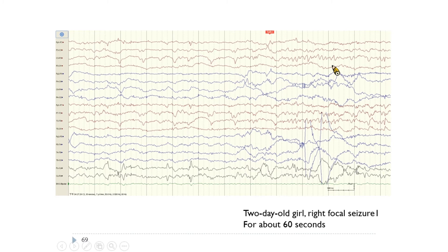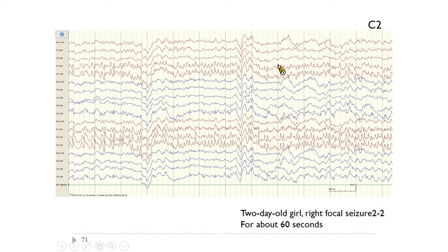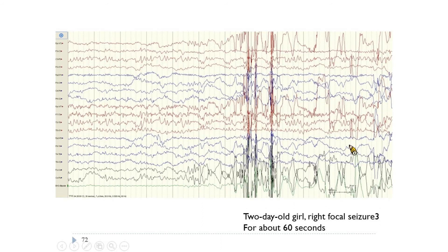This is another episode. Again, there appear to be positive periodic discharges with a broader field involving central and temporal areas, with rapid development of rhythmic discharges ranging from theta to alpha range. Changing to a CZ referential montage, we can see the maximal amplitude is at T3 and T5, continuous, resulting in a right focal seizure. This electroclinical seizure was about 60 seconds.